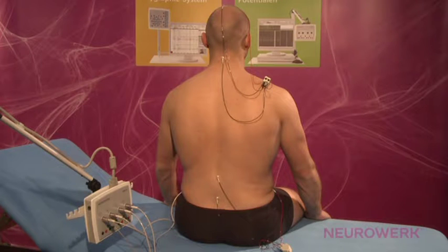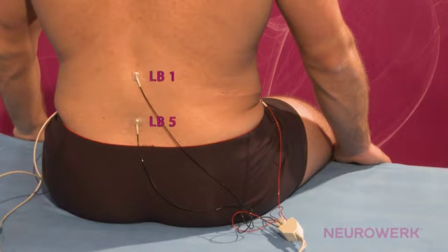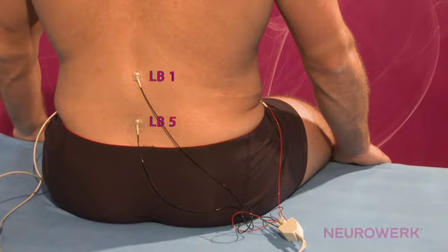In conclusion, the LB1 recording point corresponds to channel 3, while the LB5 point corresponds to channel 4. Locating LB1 is easiest if you form a straight imaginary line from the lower costal arc to the spinous process. LB5 is easy to locate when, after feeling the iliac crests, an imaginary straight connecting line is drawn. Based on this line, you need to move one further spinous process down.